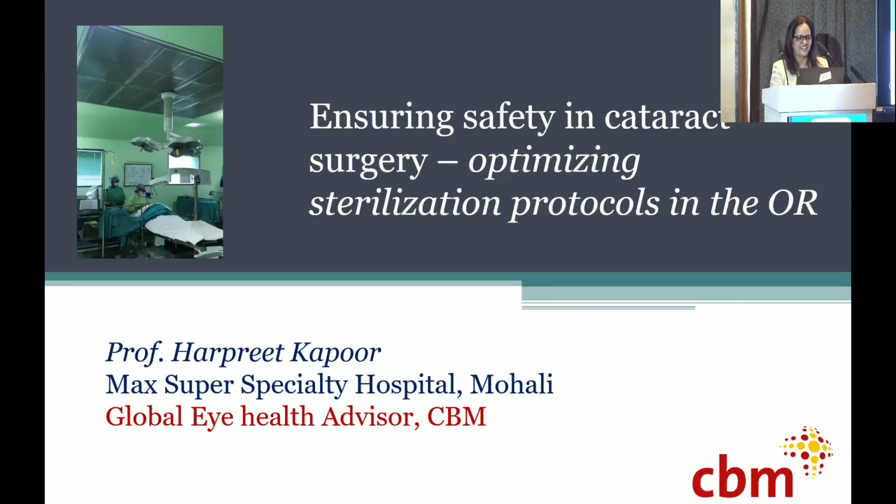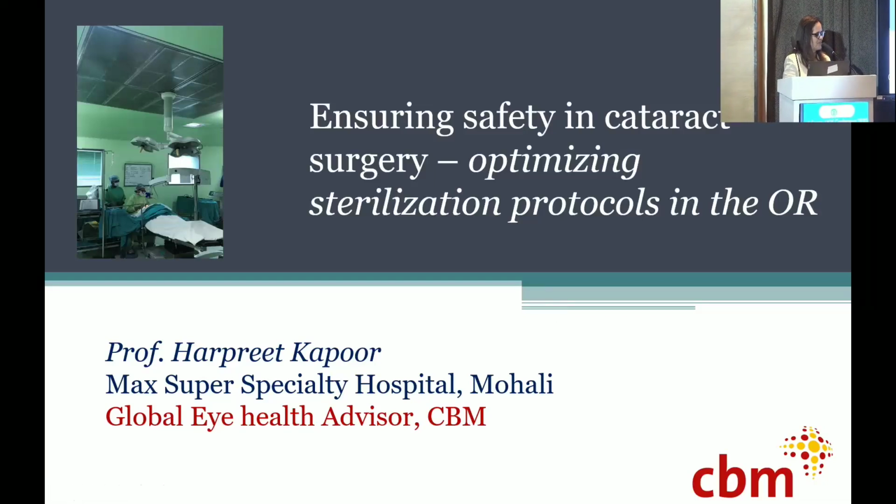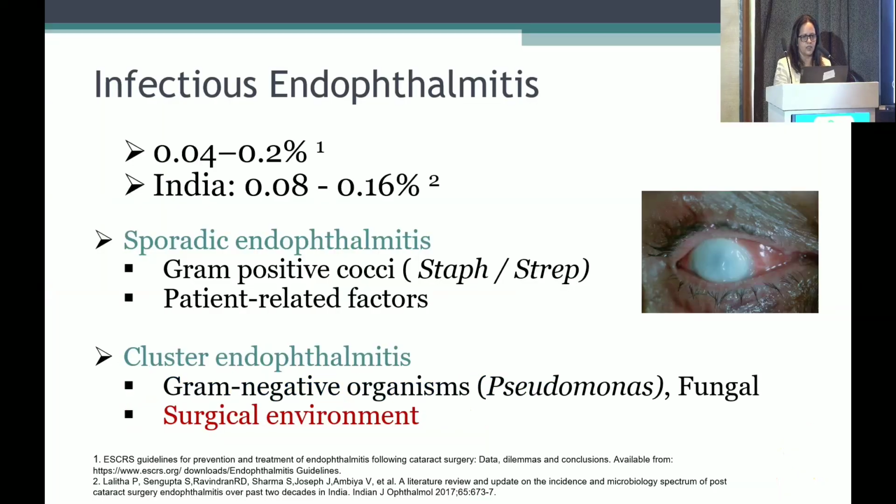We have this duty of completing our task. So I will be taking you through some of the safety measures which we need to have in place to ensure that we have a safe surgery undergoing in our hospital. And of course, the focus will be on sterilization protocols in the OR.